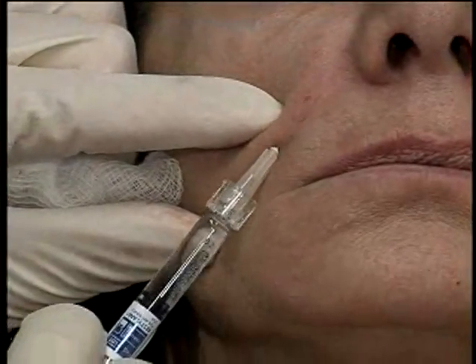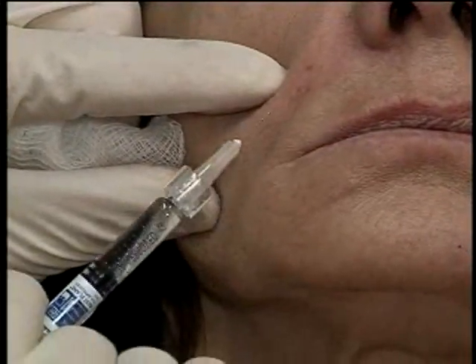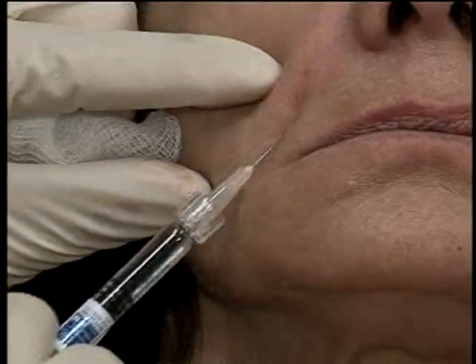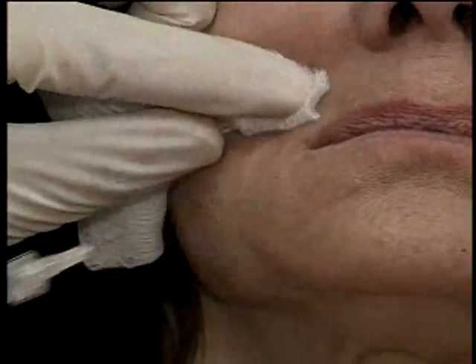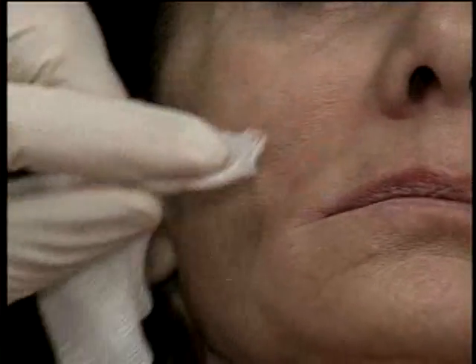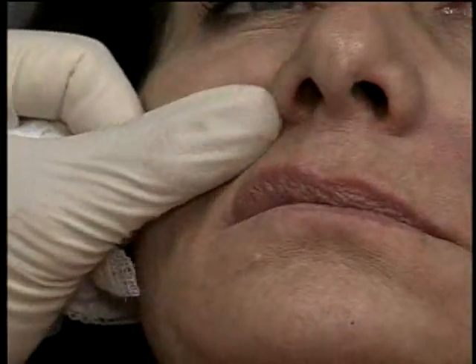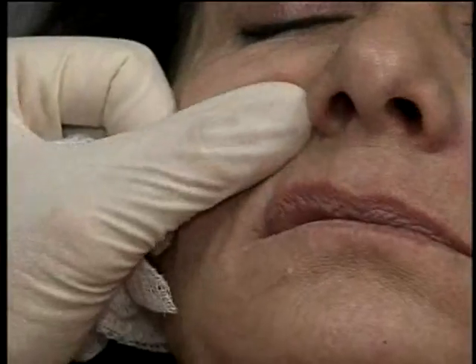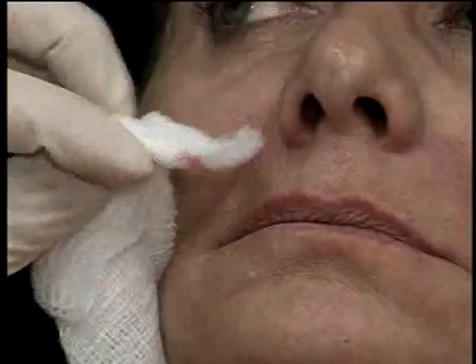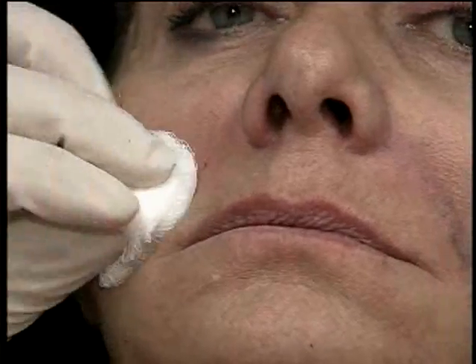I'm going to work my way down. Now you don't want to get too far down here, because if you do, you can get little areas of fullness in the lateral cheek, which won't look so good. I've noticed on my patients, when I treat to complete correction and when I treat in the subdermis, I get long-term results. And it's not uncommon for me to get well over a year, 12 to 15 months, with these patients when I treat as I'm showing you here today.